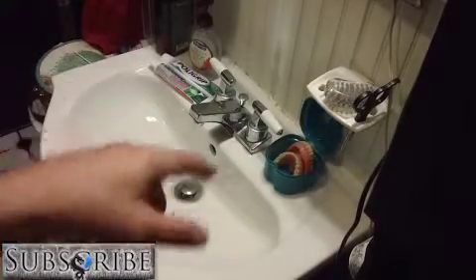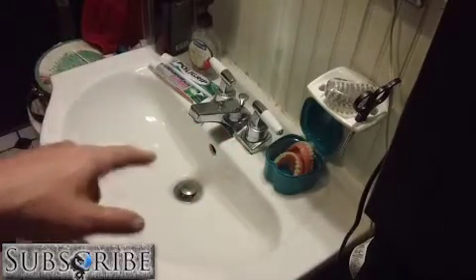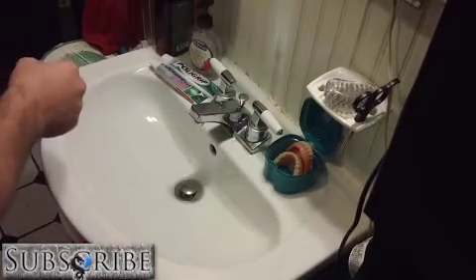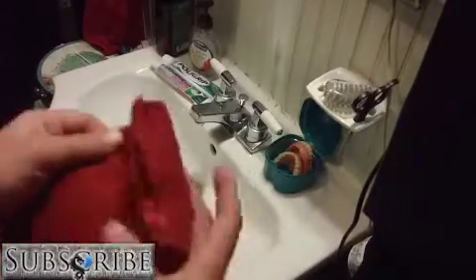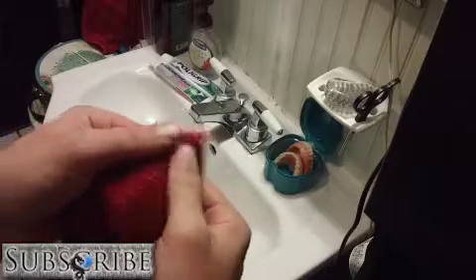Next, you've got to dry these off. I've applied them wet, and the water creates a barrier, so the glue doesn't adhere very well. So I will get a washcloth. Now, if you get a little bit of glue that you didn't get off there, and you get it on your washcloth, you'll notice it. If you go to wash your face with this, it's almost like used chewing gum that's soft. It'll stick. It's pretty gross. So use a clean one, and I would just use it for this only.